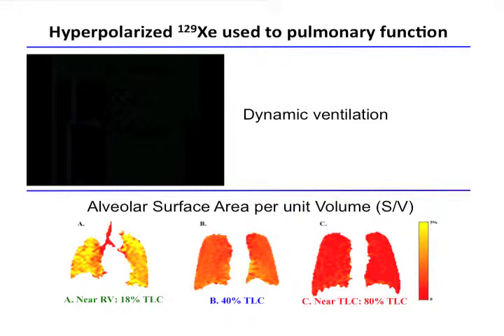As most of you know, making an MRI image of the lung using standard protons is very, very difficult, mostly because the lung is full of gas spaces. And so we use this hyperpolarization technique that Aaron Grant described to you, not for carbon-13, but to magnetize very highly either helium-3 or xenon-129.